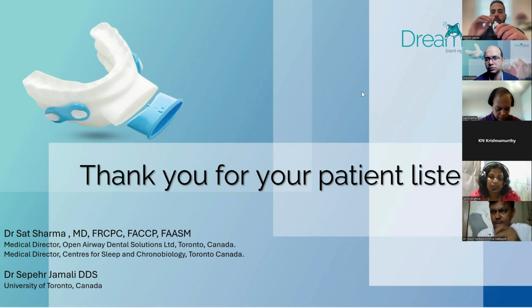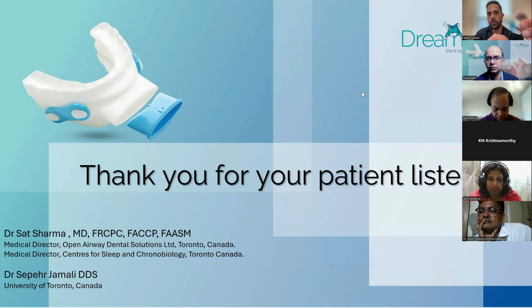So maybe in those patients, they may not get the full benefit of having the X valve. And for those patients, I had maybe 1 or 2 patients, or if they don't like the protrusion to come out in some women, we can use the mini version for them that doesn't have the lip protrusion part. But again, there are very few patients like that.